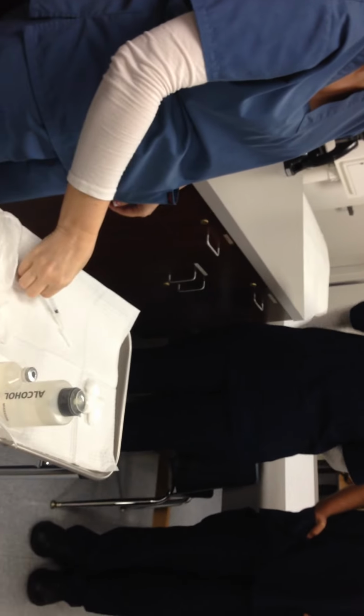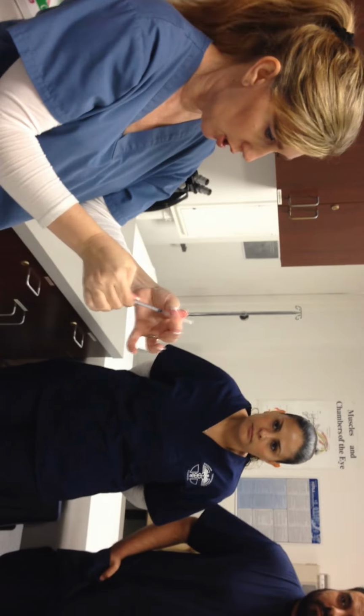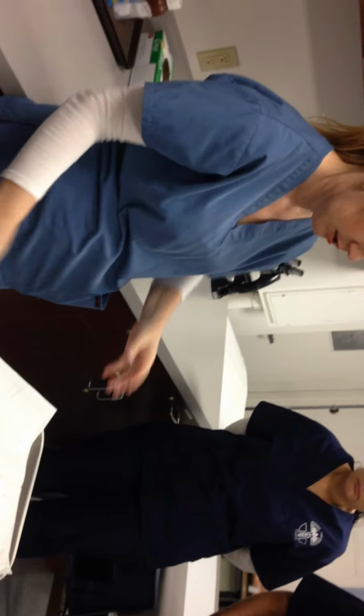One hand scoop technique. Okay? Boom. There we go. Now we don't have to push it all the way on. It's a little bit loose here, which is fine, just like that. And then you're going to come over here.